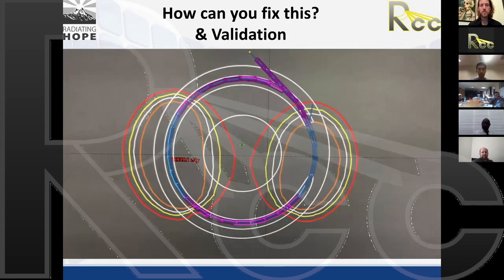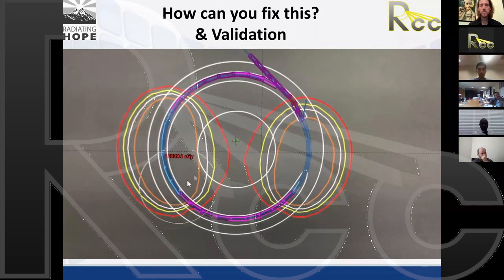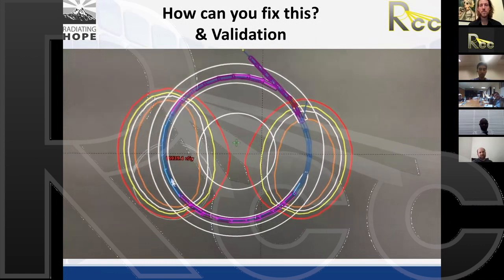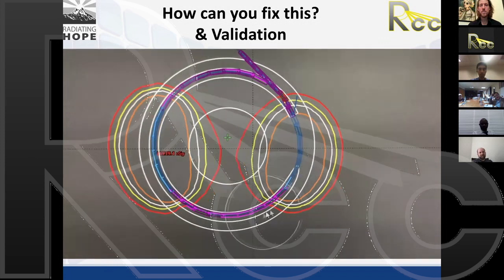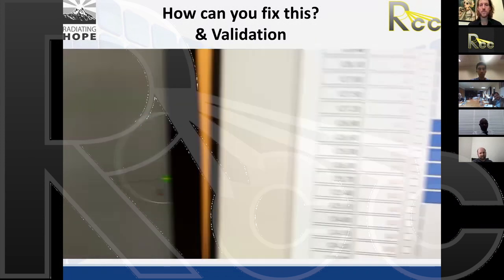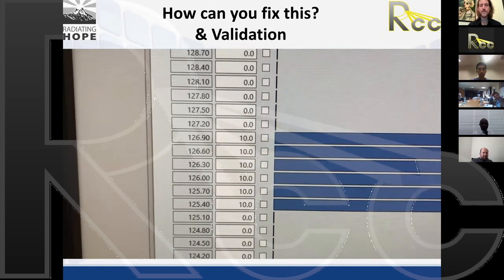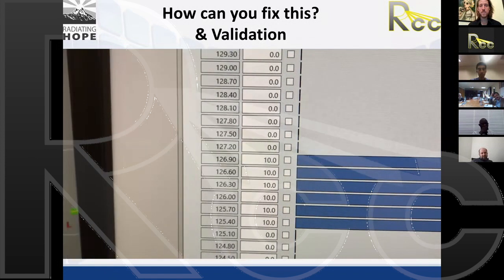Okay, so if we want to deliver positions in the dose in the patient that looks like this, one option would be to actually shift our planned dwell positions, which are here and here, around away from the inner lumen by 5 millimeters. So here are our dwell positions originally, let's shift them away from the tip by another 5 millimeters. Okay, so now we just have new dwell positions shifted away 5 millimeters.